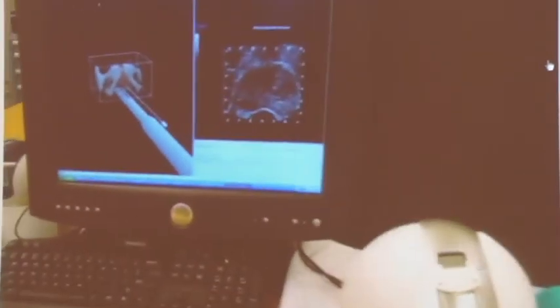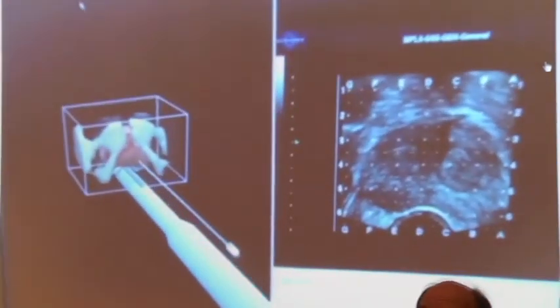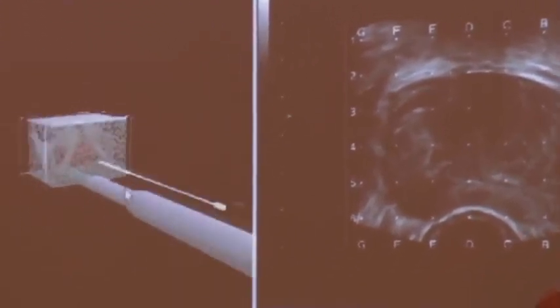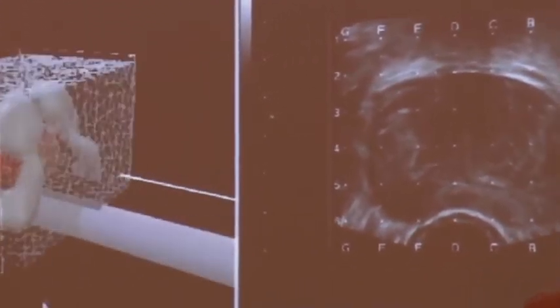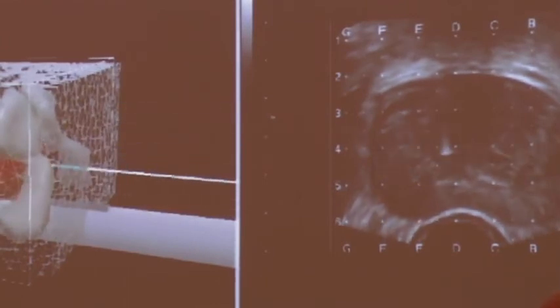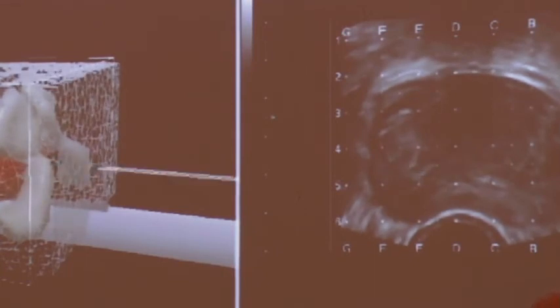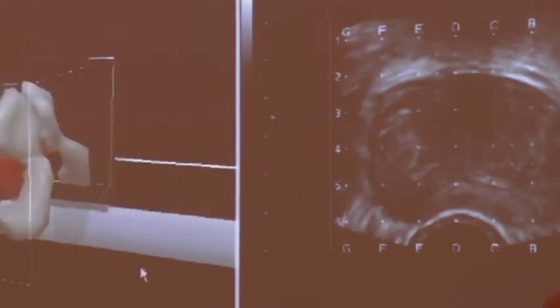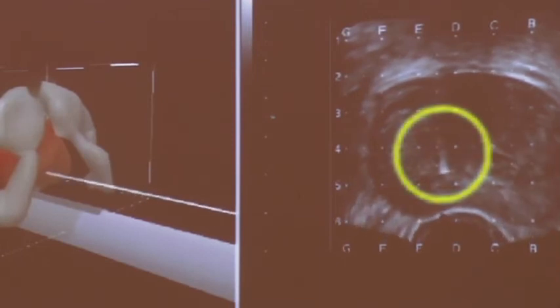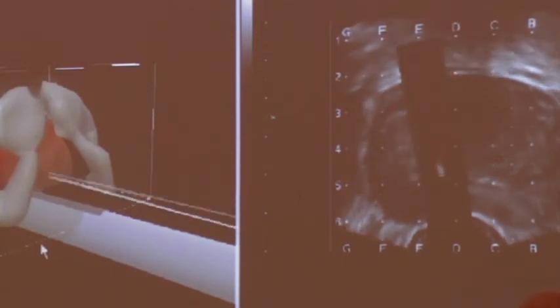But the beauty of this approach is that with a bit more work, and maybe a lot more work, you could make this patient-specific. You can acquire the volume study and the elastography data at the same time. You have to do a little bit of segmentation of the bone. Then you can say, I have John Smith that I'm doing on Thursday morning, and I'm worried that his pubic bone is a bit lower than I expect, and I may have to readjust the transducer.